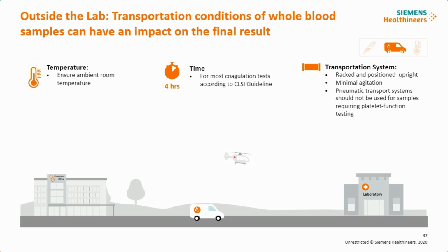There was an elegant study that was done, I believe in 2006 by my alma mater, Washington University. What they essentially did is they took an iPhone and stuck it in the pneumatic tube system, if I remember correctly. There was some type of app that they were able to download. They took that sample to different locations within the hospital and just sent it to the lab, and they measured the G-force that the sample would undergo as it's going from various locations. And they saw that there was a difference.